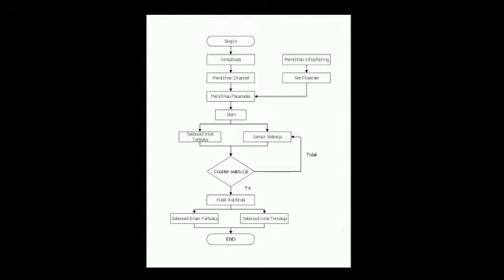Process or flowchart. First, when the device is turned on, the LCD will initialize. Then, set the flow rate on the infuse pump or syringe pump and select the flow rate parameter on this tool. Press start on the device.